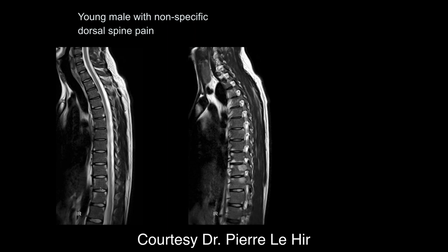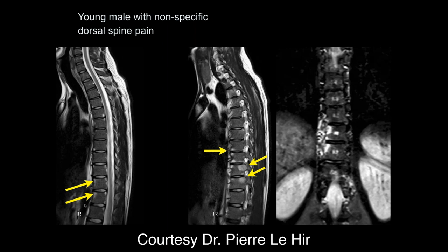I think that's right. On the coronal we can see this clearly. This looks like early ankylosing spondylitis — this is a young male, and in my view this probably isn't too early. This is ankylosing spondylitis.